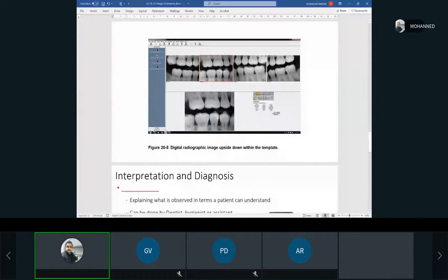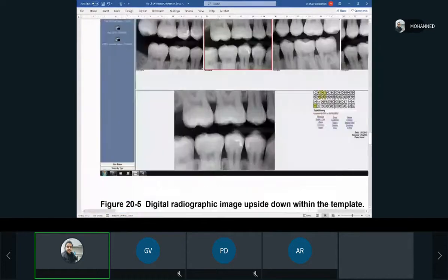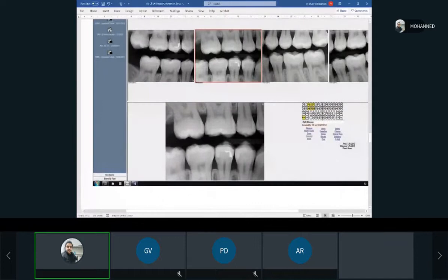So you can see, one thing about this, definitely, not all of the digital ones will get correctly placed. So there are still some errors. We have to rotate, we have to mirror some of these x-rays or images. So there are a lot of different things that we can do. Things can go wrong. We cannot rely on the software to do it automatically for us, because these are not smart software.